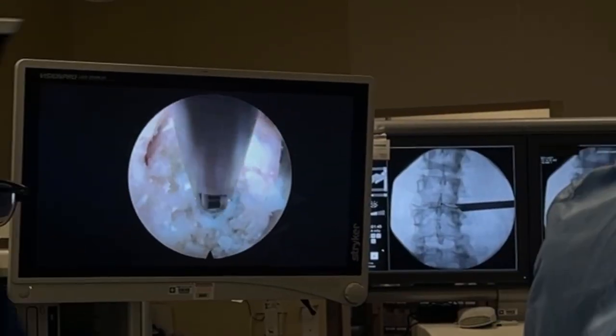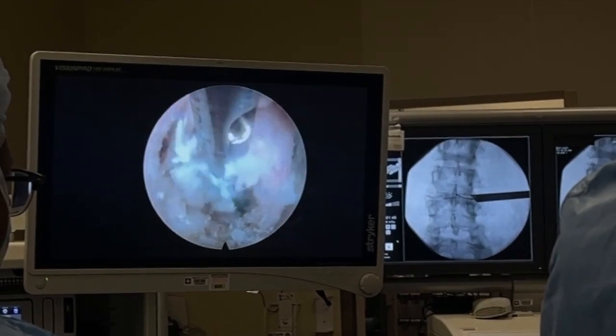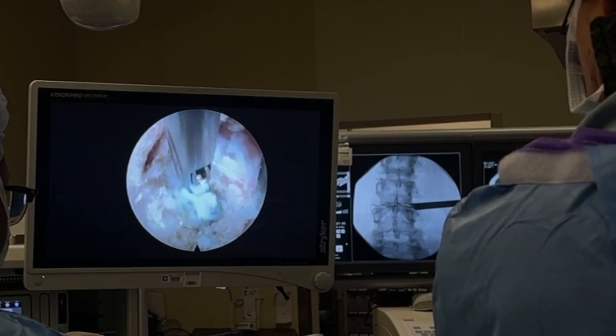It's like a scalpel. It's scary if you don't know what you're doing. There's a little hint of blue now. I can see part of the disc that is disrupted from the inside. Right there. You can see the disc herniation coming out. It's like popping a pimple. It's oddly gratifying. But it's like my teenage kids. Not gonna come out without a fight.